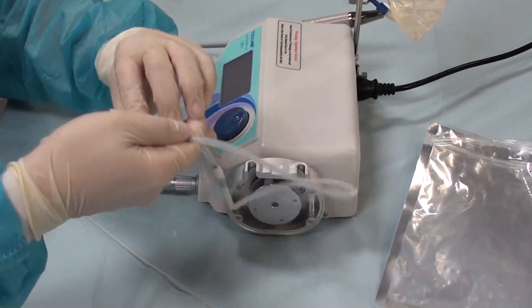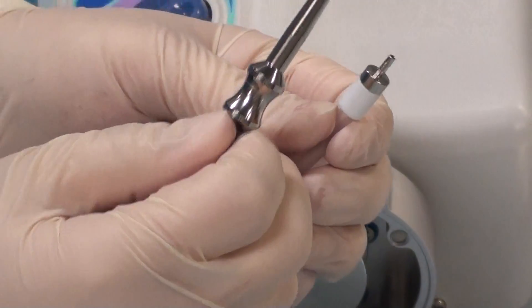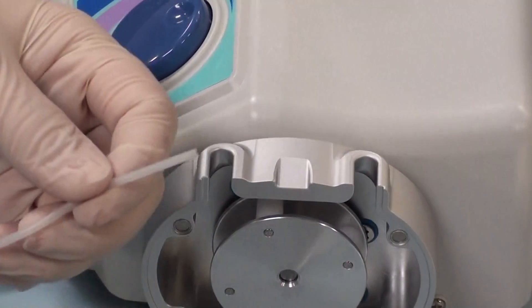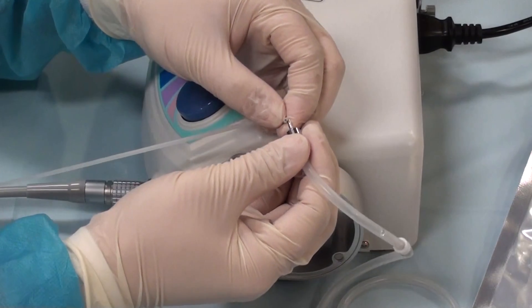There are two sides, two ends. One end has a spike, which you plug into your water source, and the other side has a nipple, which plugs into the handpiece irrigation tube, right here. You want to attach these first.